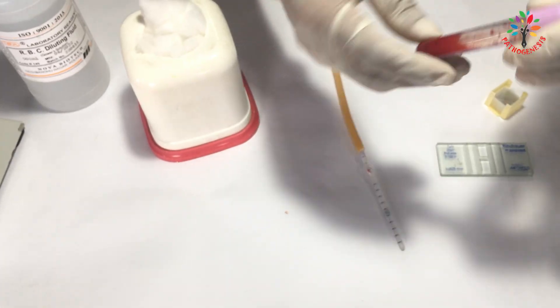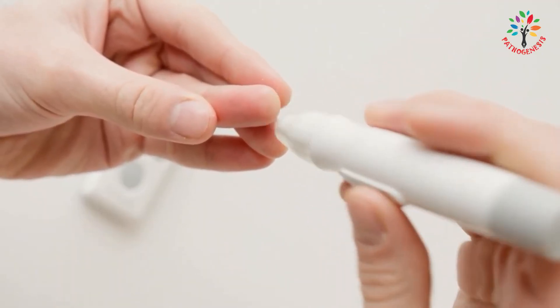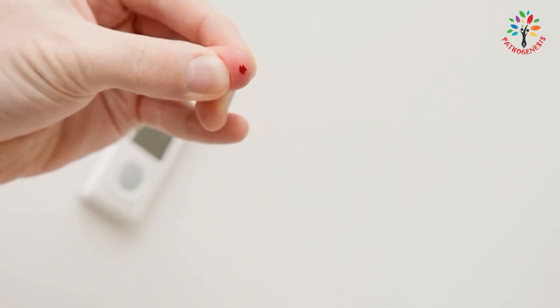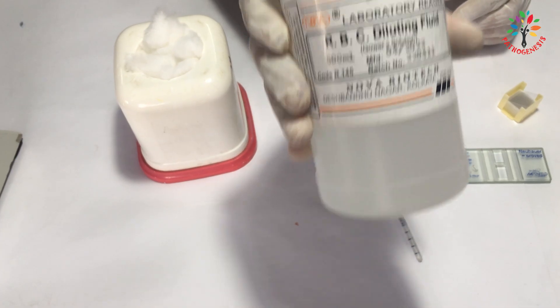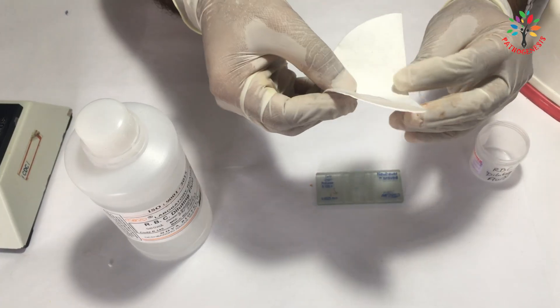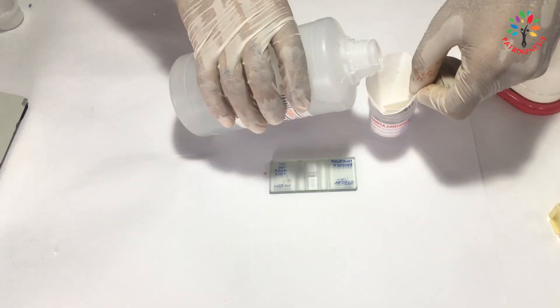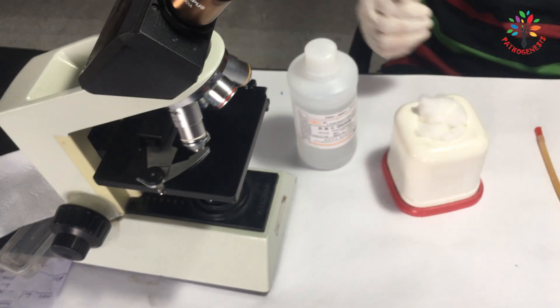We need an EDTA blood sample. Since this test requires 20 microliters of blood, capillary blood from a finger prick can also be used. We need RBC diluting fluid to dilute the blood sample — Hayem's fluid and Dacie's fluid can be used. Filter the diluting fluid with filter paper to prevent any dust particles. Finally, we need a microscope to count the red blood cells.